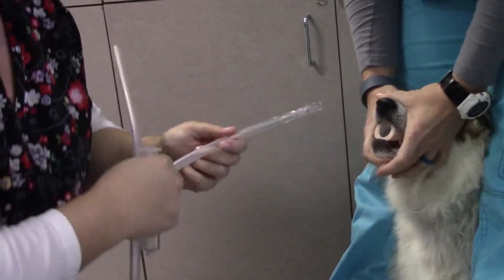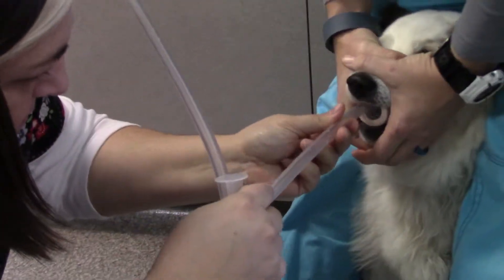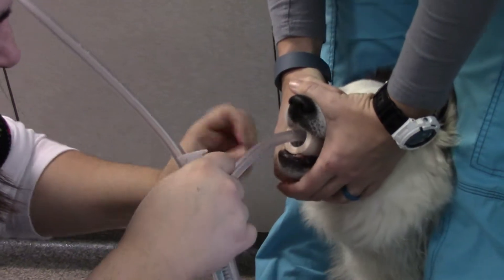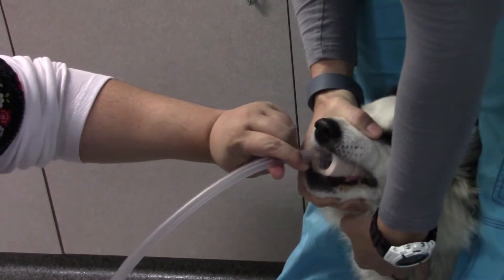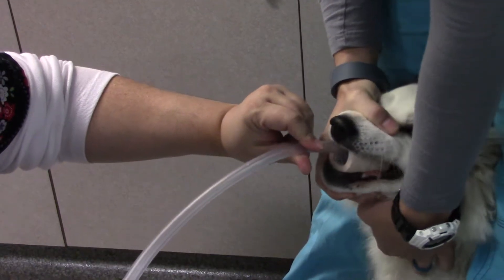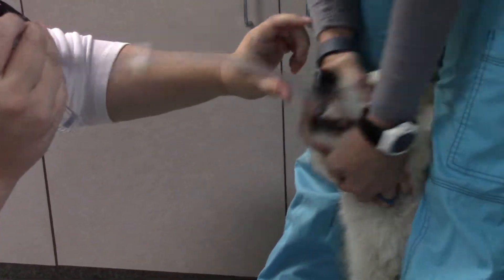I think it doesn't have any canines to hold it in. It doesn't. You're fine. Okay, bud. Good boy. It's okay. It's weird, huh? Don't fight it. You're fine. Good boy. You're fine. Almost there, Andy.